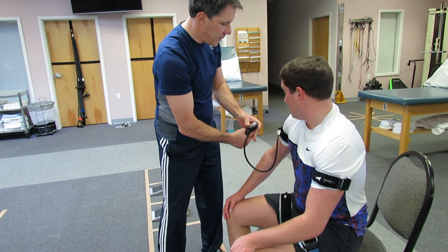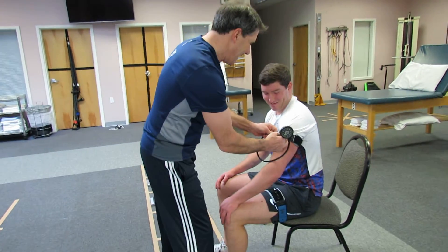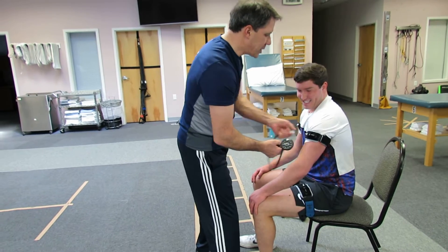It's very fatiguing, as you will find — even with very, very little weight, heart rate's racing, isn't it? So we readjust him.